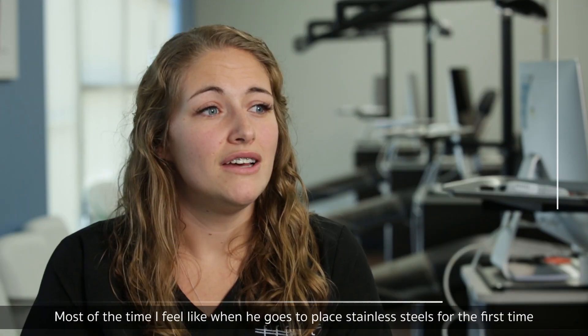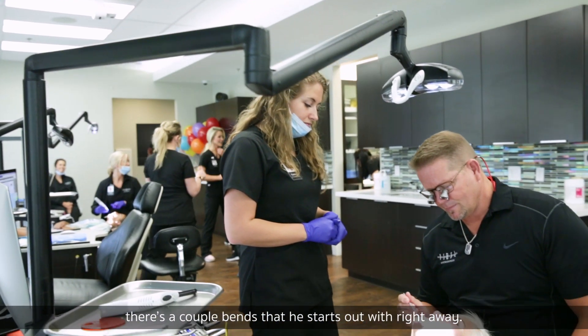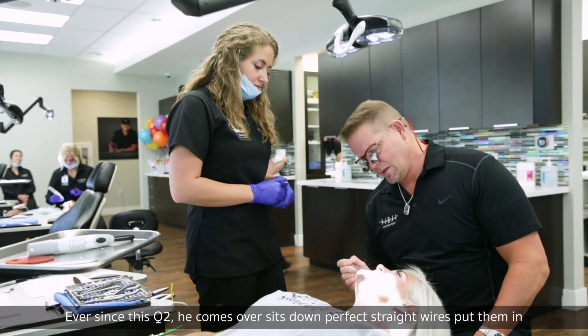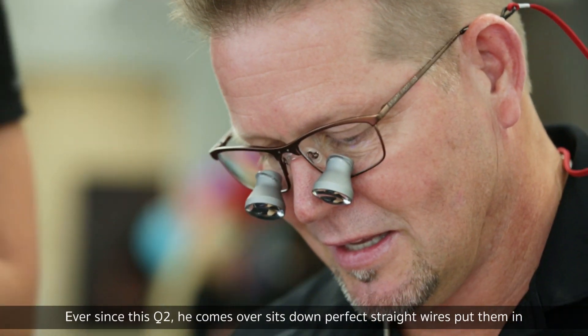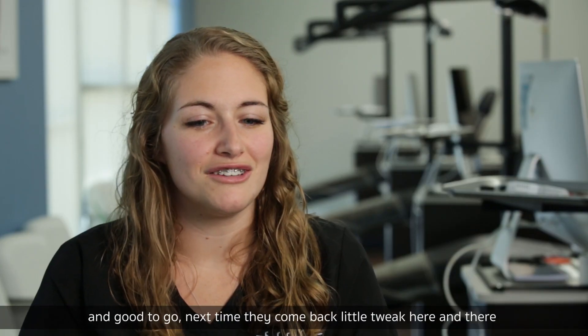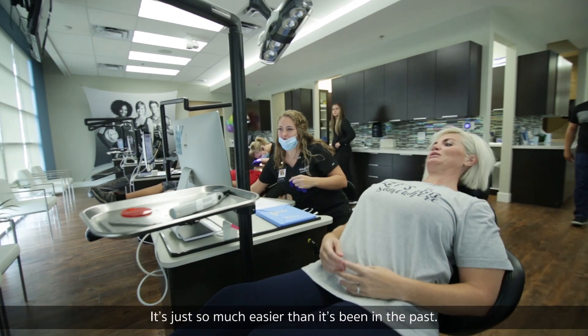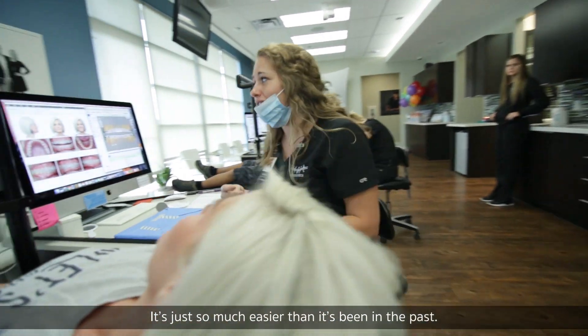Most of the time, when you go to place stainless steel for the first time, there are a couple of bends right away. Ever since this Q2, he comes over, sits down — perfect, straight wires, put them in, good to go. Next time they come back, a little tweak here and there, and now we're more focused on elastics and bite. It's just so much easier than it's been in the past.